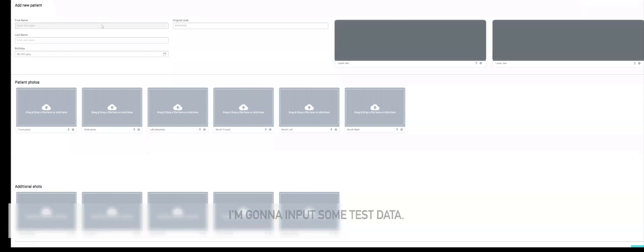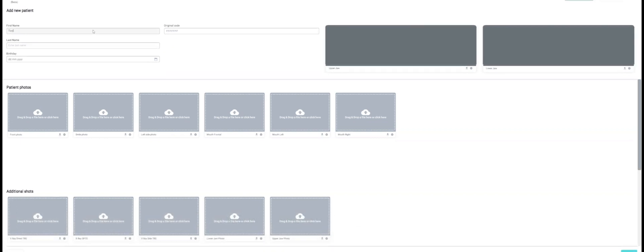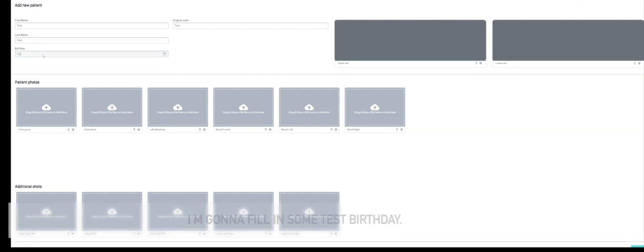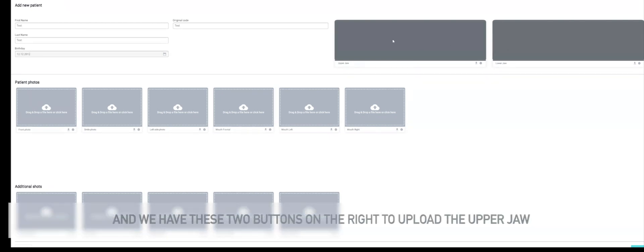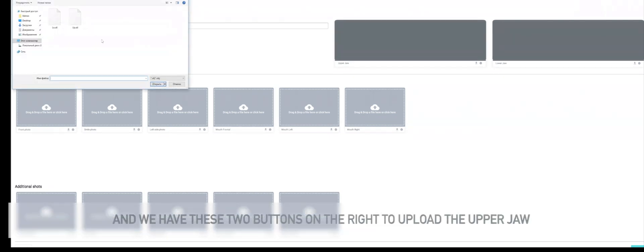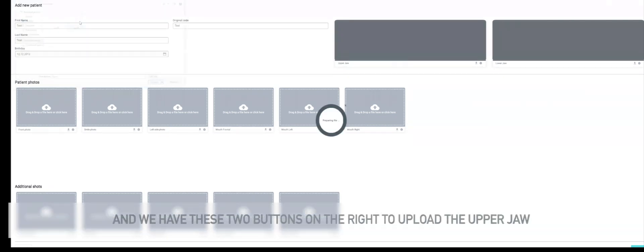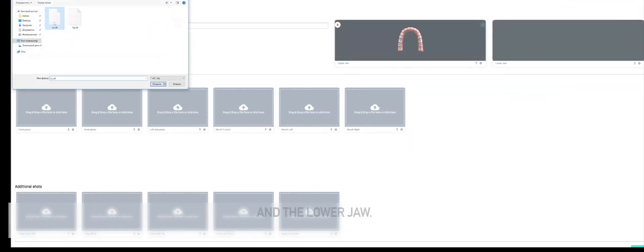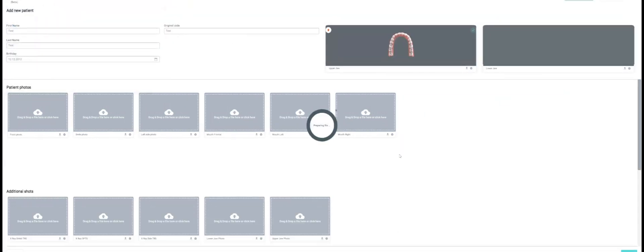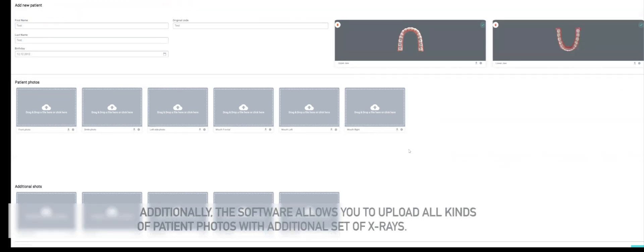I'm going to input some test data, fill in some birthday, and we have these two buttons on the right to upload the upper jaw and the lower jaw. Additionally, the software allows you to upload all kinds of patient photos with additional x-ray sets.